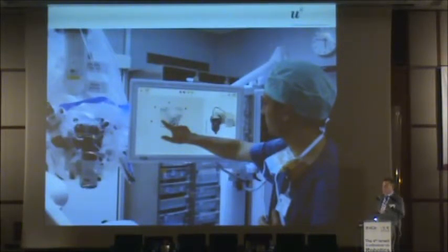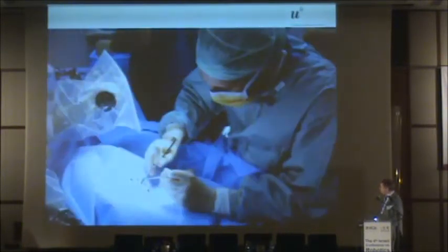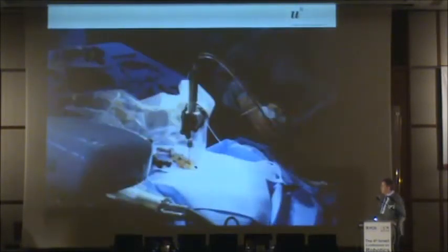The doctors operate, they put sterile gloves on and so on. We have the cadaver head here, it's draped, the robot is here, it's also draped. The surgeon does everything he or she will do in a normal procedure. Then we bring in the robot to drill a hole. You already see how we have only the 4 screws here, a small incision with a drill, through which the drill can go and drill the hole.